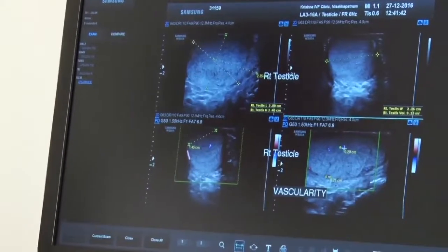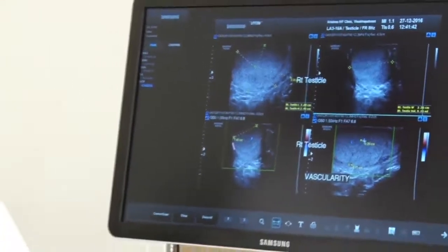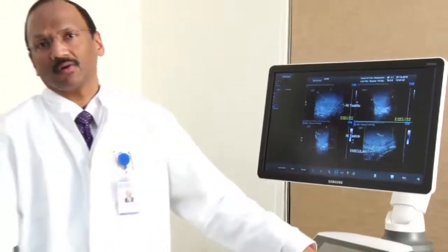In turn, this scrotal ultrasound also picks up certain early cancers which are sometimes present in the testis. So using scrotal ultrasound will help us to find additional causes of male factor infertility. It also helps us to find out whether that particular problem can be treated with medication or only technology can be used. And the third thing is whether the count is going to get reduced in future. These are the uses of a scrotal ultrasound in the current context.